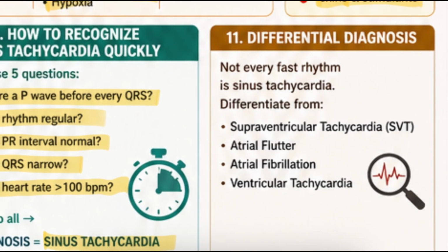So, differential diagnosis of sinus tachycardia. Not every fast rhythm is sinus tachycardia because we have to differentiate it from supraventricular tachycardia. In upcoming videos, we will discuss this. Atrial flutter, atrial fibrillation, ventricular tachycardia, everything we will cover in our upcoming videos.